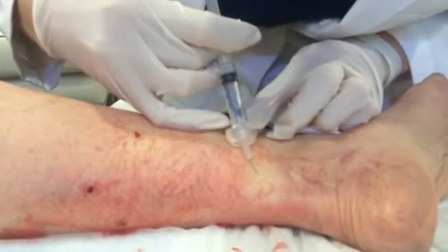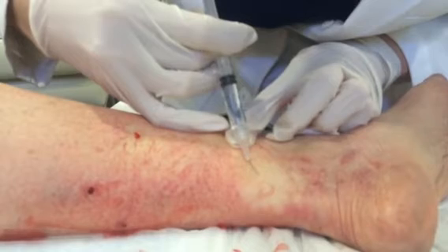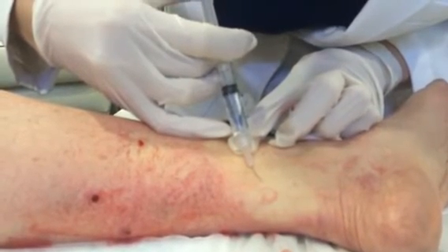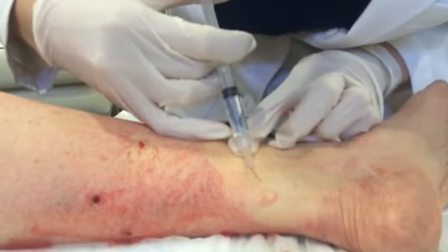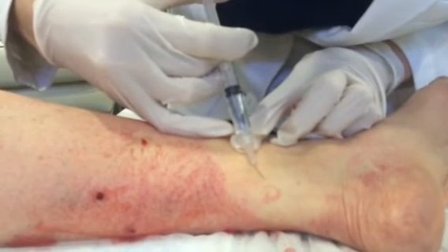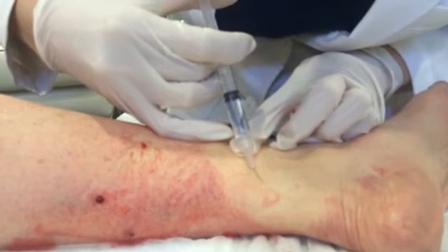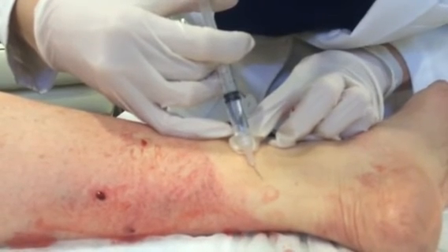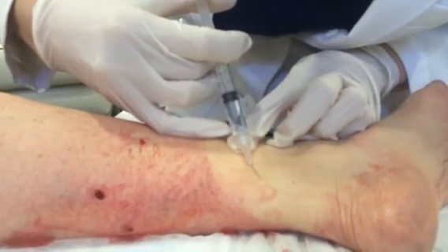We'll do one more. It's really nice — instant gratification. You know if you're in the vessel because you can actually see it blanching. That'll be a little bit crampy for the patient. And with that, we'll go ahead and stop the demo.